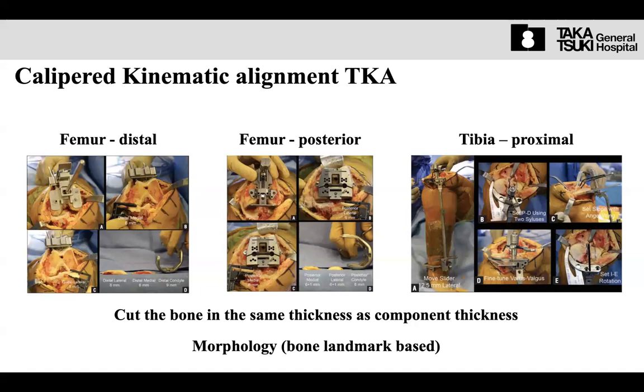Skiving means, what can I say, the saw blade curving on the hard bone. Normally the cartilage wear side tends to be thinner in cutting thickness due to skiving on the hard bone.